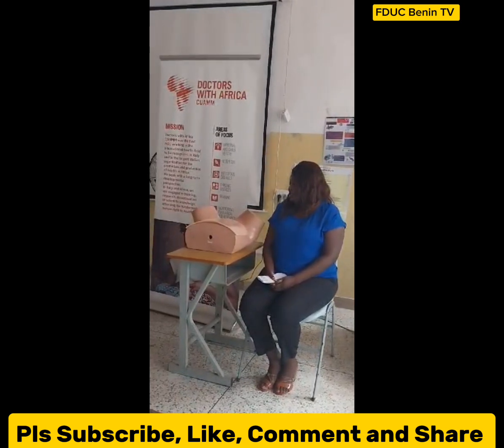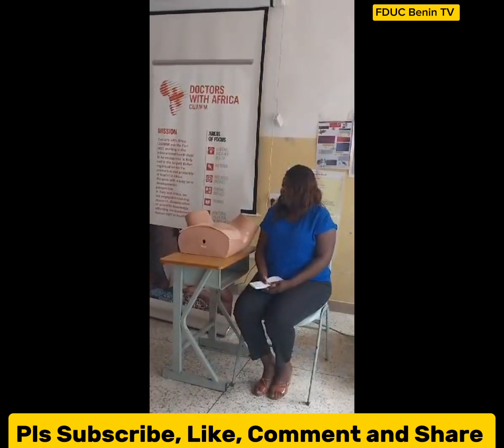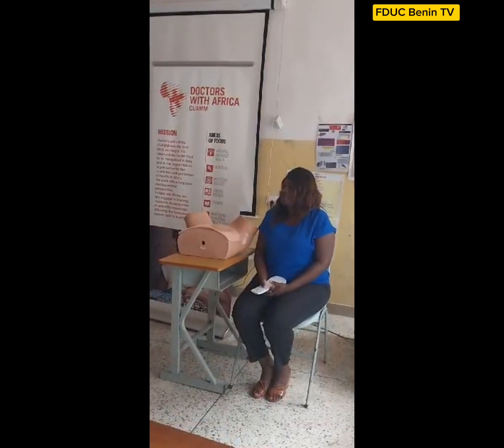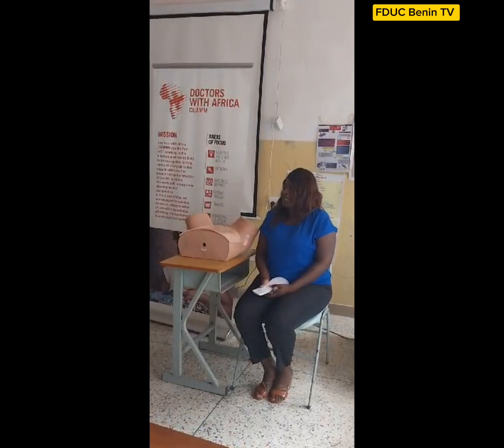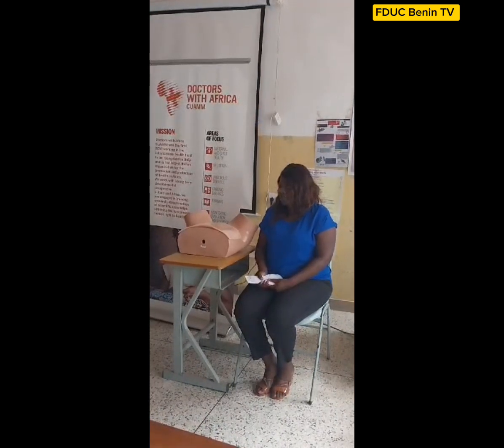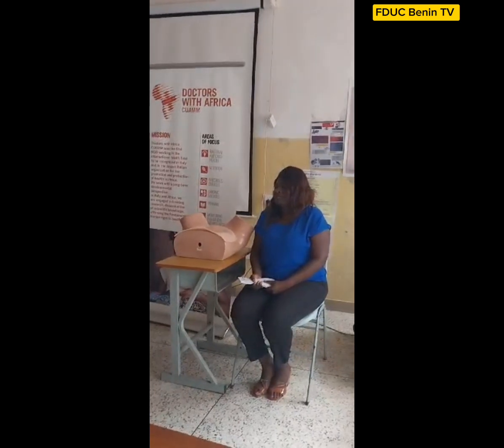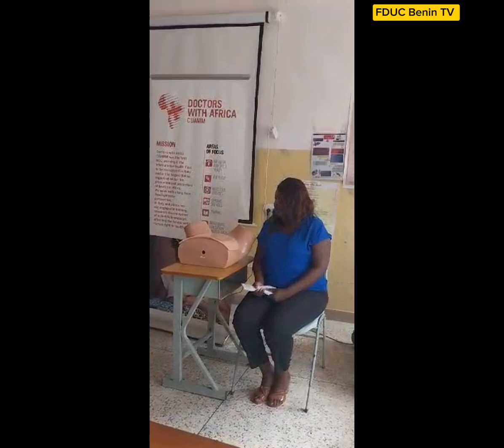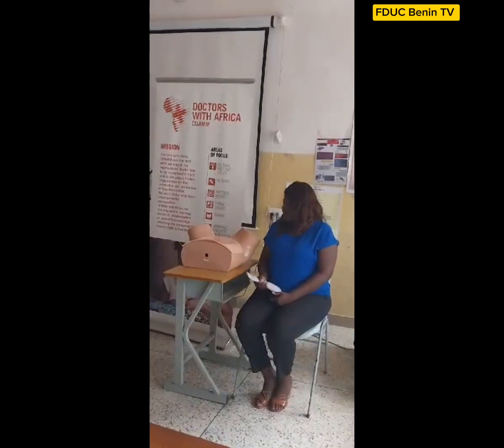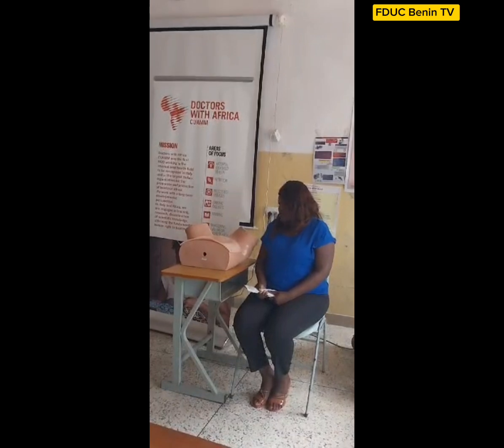Okay, so after that, I'll review the indication for the scan, and then I'll also make sure my ultrasound scan machine is on, and that the orientation probe is to the left of the screen. Then I'll also input the biodata as well as the last normal menstrual period. So after doing that, I'll ask the patient to lie down, and I'll expose the patient adequately.